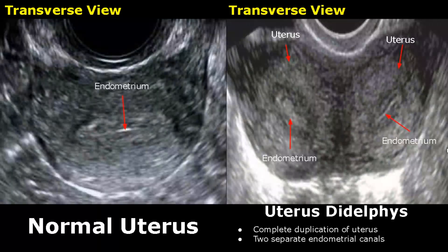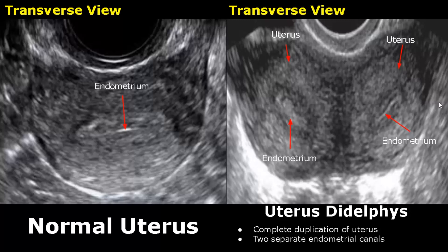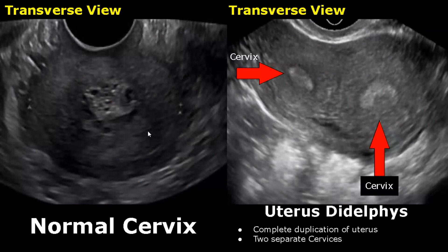Here we have transvaginal images in the transverse plane. This is the normal uterus and this is uterus didelphys. We can see two separate uteri and two separate endometrial canals. These are transverse images of the cervix taken transvaginally. Here is the normal cervix, and over here we have two separate cervices as well, because there is complete duplication of the uterus.